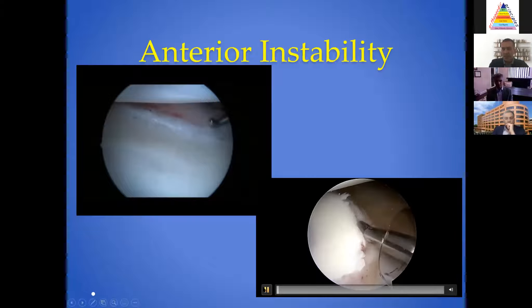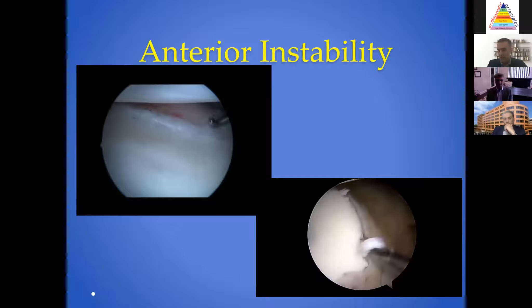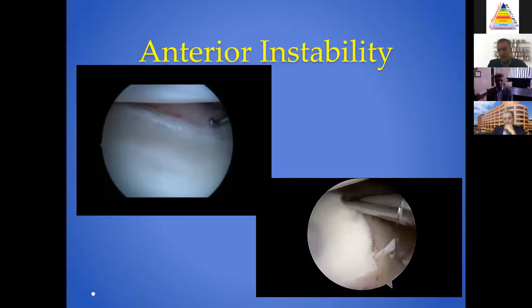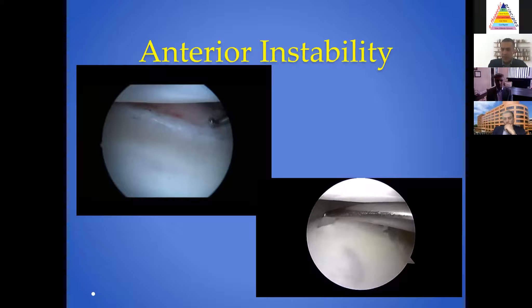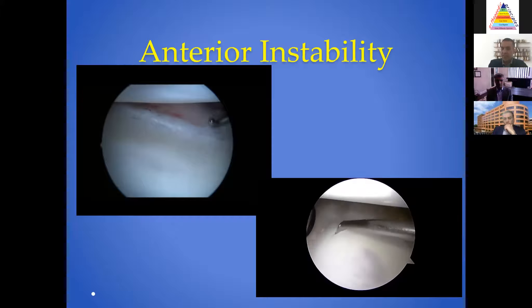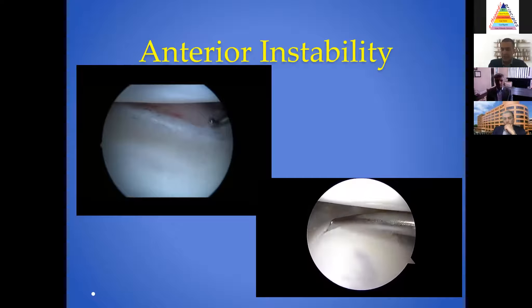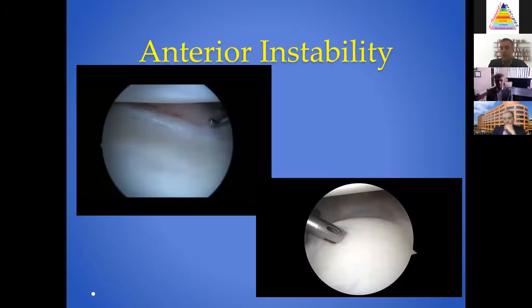Looking from the front, I'm using an open curette — this is a Sanjay Desai technique where you clean the cartilage. You can come across the labrum with a steeper liberator and really get to the posterior labrum from anterior and vice versa. Those are some nice tricks.